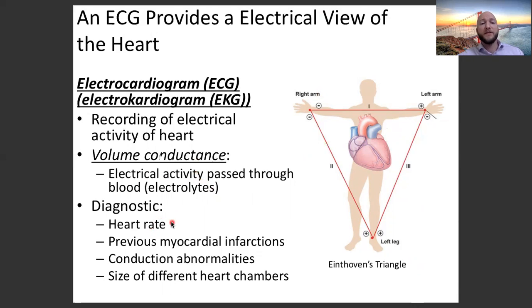Electrocardiograms are very diagnostic of a number of things. They can give us a lot of information about the function of the heart. They can tell us heart rate, which we'll be doing in this lab. They can tell us about previous myocardial infarctions, conduction abnormalities, and the size of different heart chambers.